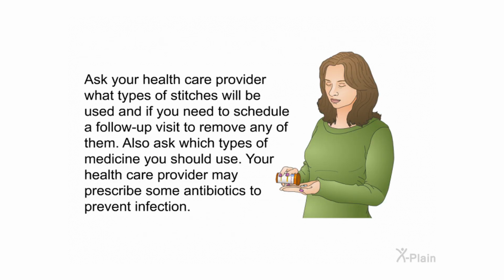Ask your healthcare provider what types of stitches will be used and if you need to schedule a follow-up visit to remove any of them. Also ask which types of medicine you should use. Your healthcare provider may prescribe some antibiotics to prevent infection.